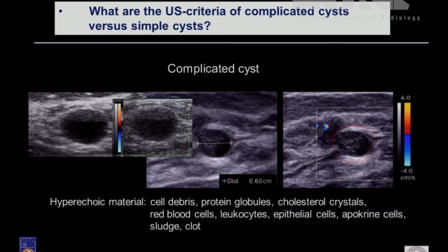The next point: go for a color Doppler. Study whether there is perfusion inside this hyperechogenicity. If you find vascularization inside, then there is something wrong — this has nothing to do with a complicated cyst. In an oil-water fluid level, you don't see any vascularization, and also on the right-hand side you don't see vascularization inside the complicated cyst. Outside can be vascularization, but not inside.